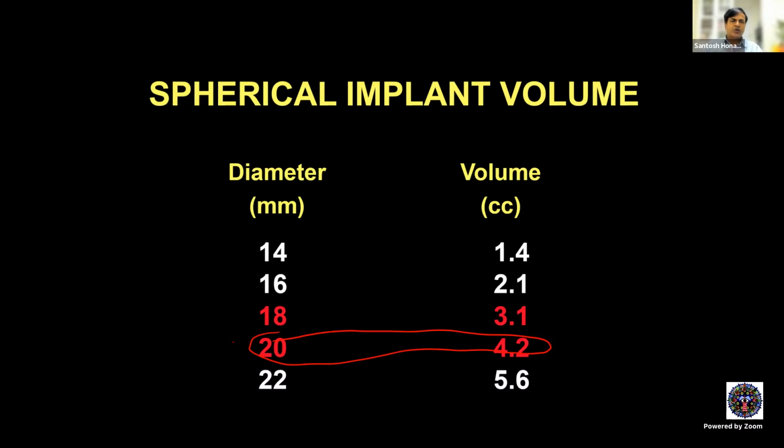If there is mooning of the implant, that means that it has a higher tendency to extrusion, because even after you close tenons, it will still have an anterior propulsive activity, or it moons out. So it will possibly have thinning of the conjunctiva, or even extrusion or a tendency to extrusion.